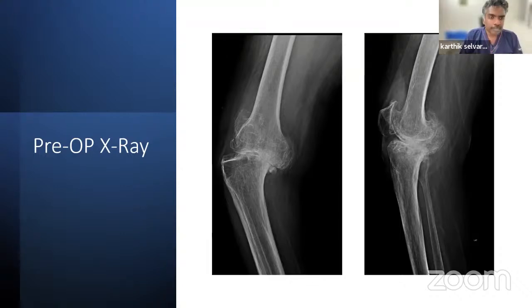Okay. Others you can proceed. One thing I just want to tell you, this broken osteophyte is there. This is the thing you have to be careful about, as I was telling repeatedly. If you are a little bit careless, the moment you try to remove this, you will cut the MCL. Suddenly everything will get opened up on the medial side. So for this osteophyte on the medial side, the release you have to always do as a sleeve. And this osteophyte you have to remove very, very slowly. Little bit harsh, then you have cut the MCL.